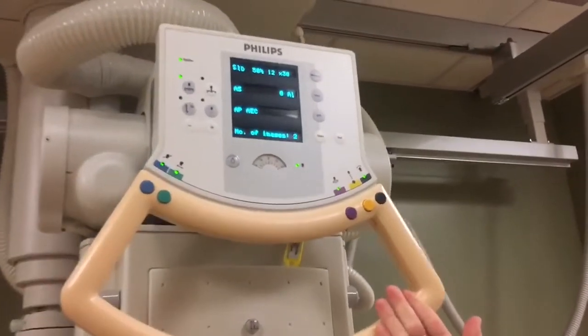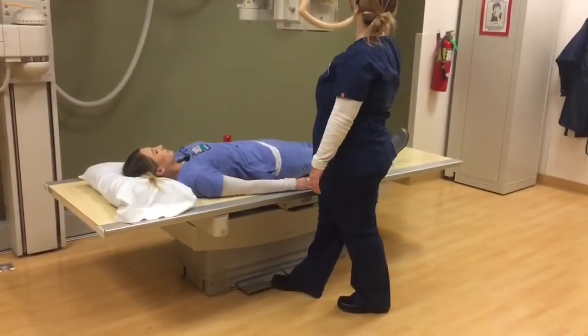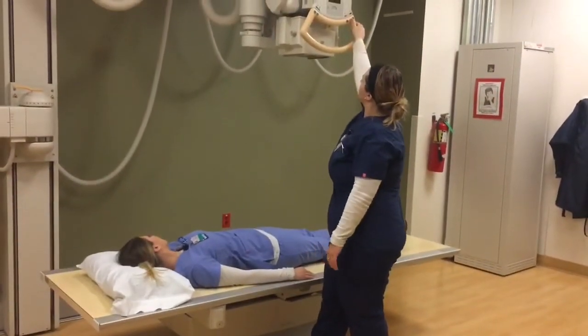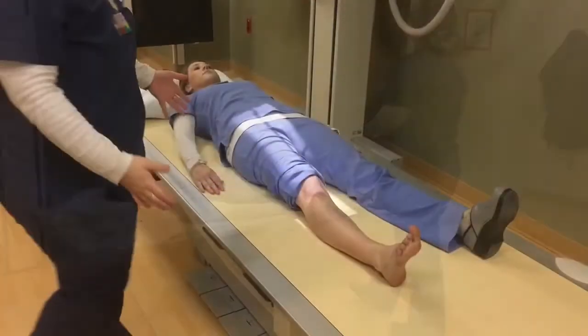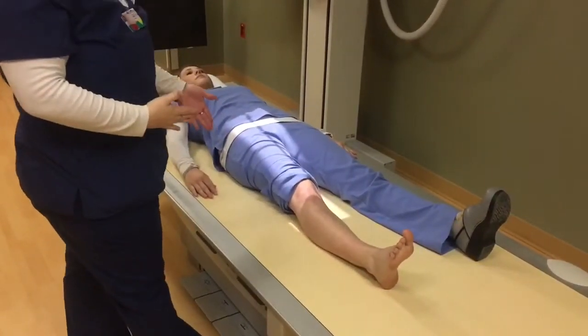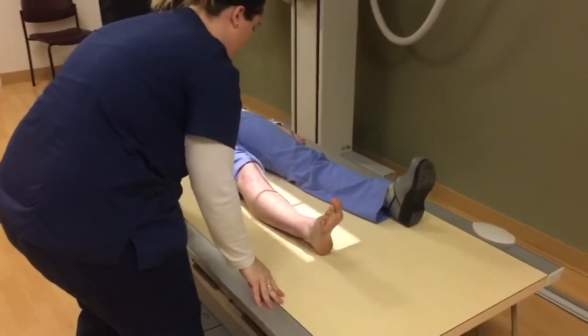I know that it's ready for stitching because it says number of images 2. Some systems require that the table be lowered all the way and the tube head be raised all the way up to allow for stitching. Now I'm going to position my part. I don't want to touch the tube or the bucky since I already lined those up and detented them. I will move my table into the position I need.